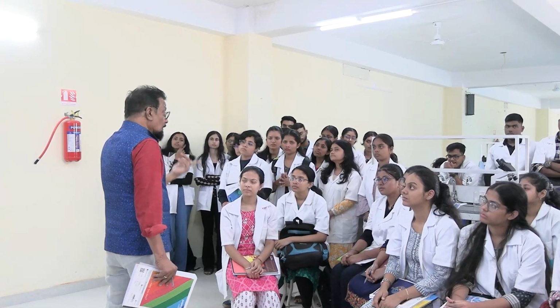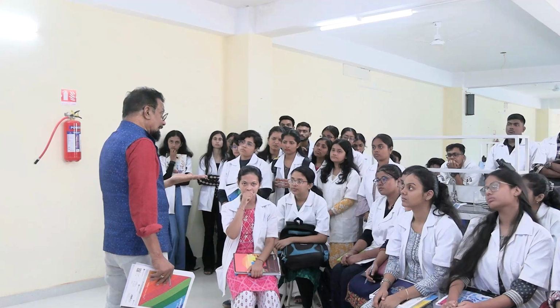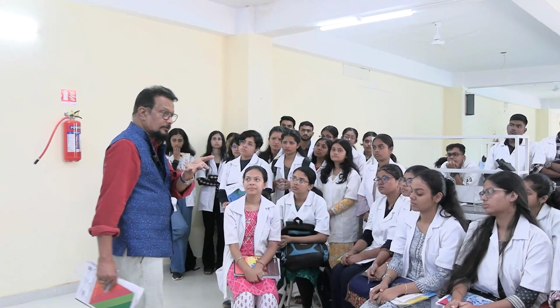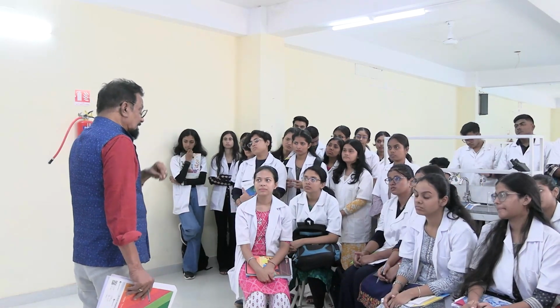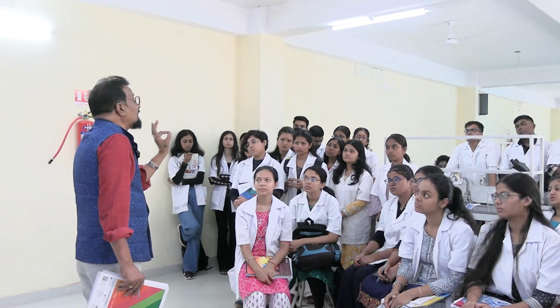After making the smear, staining it, drying it, you have to study this under the microscope. First you have to recognize and identify them. Then your part is to go for the differential count.